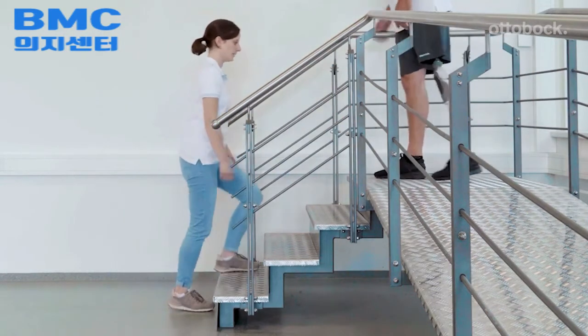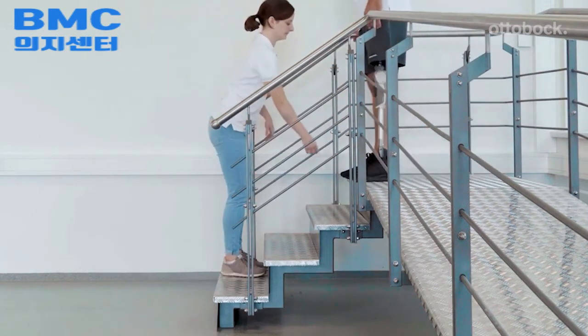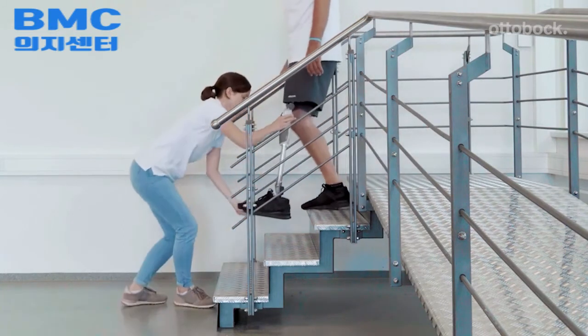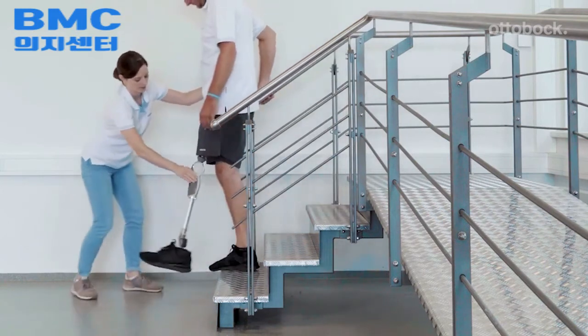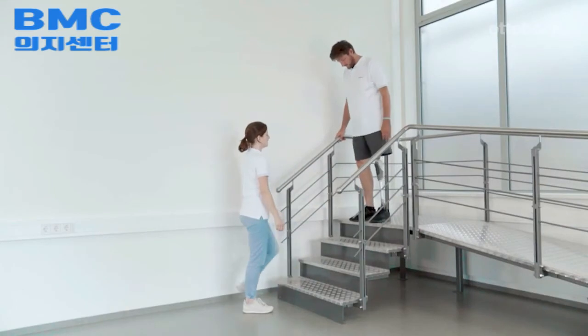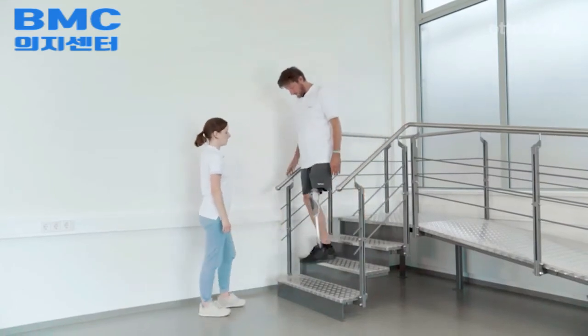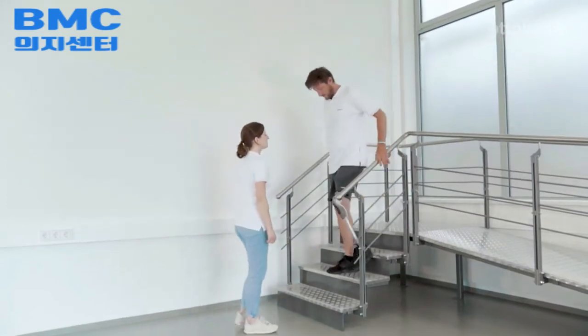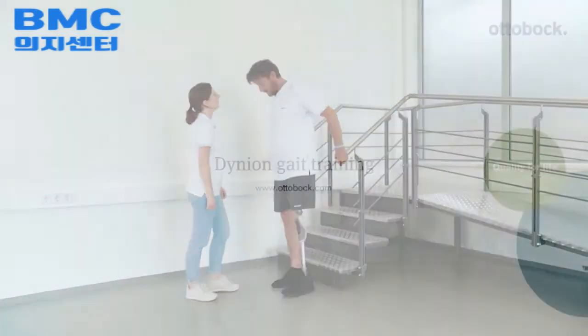Proper foot placement is also important for walking downstairs step over step. Start the training using the contralateral handrail and make sure the upper body stays upright. Use of the ipsilateral handrail increases the intensity of training because the model must load the prosthetic side more.